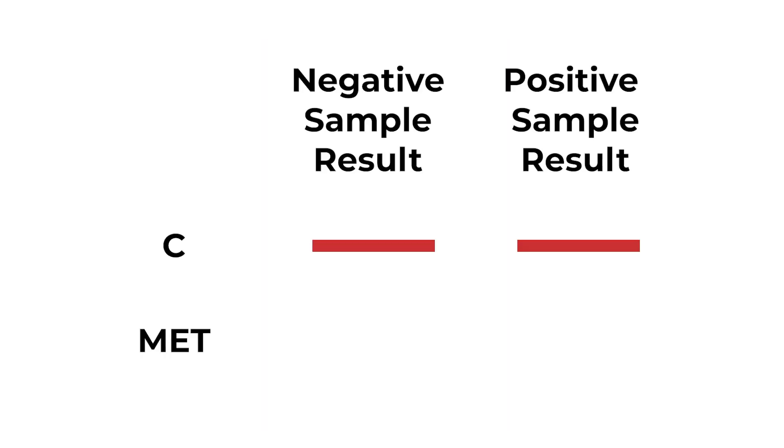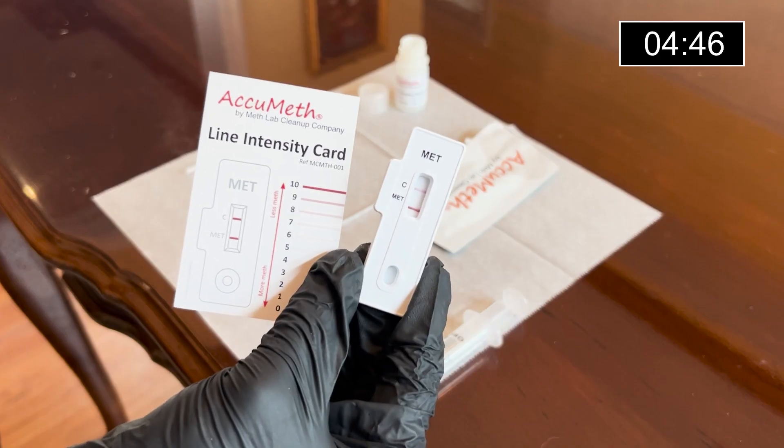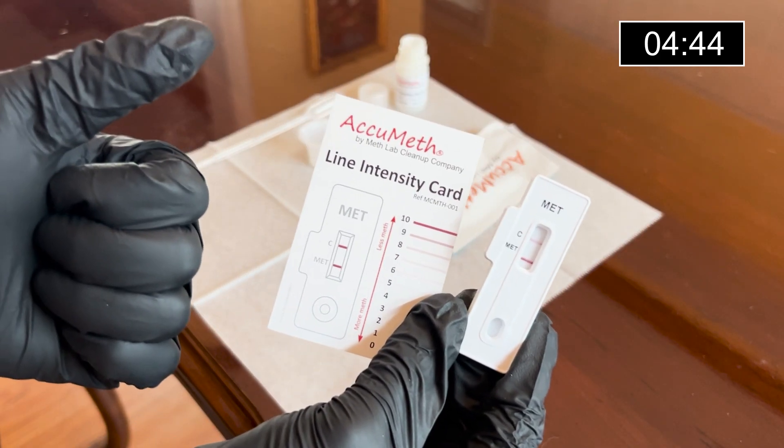The sample can be considered negative for methamphetamine residue if the MET line on the test cassette has an intensity of eight or more. On the other hand, the sample can be considered positive for methamphetamine residue if the MET line has an intensity of seven or less, or is not present at all. The lighter the MET line on the test cassette, the more meth residue is present in your sample. Our sample here can be considered negative for methamphetamine residue.